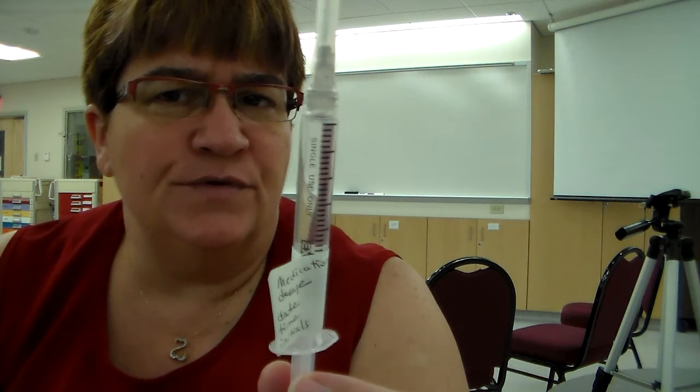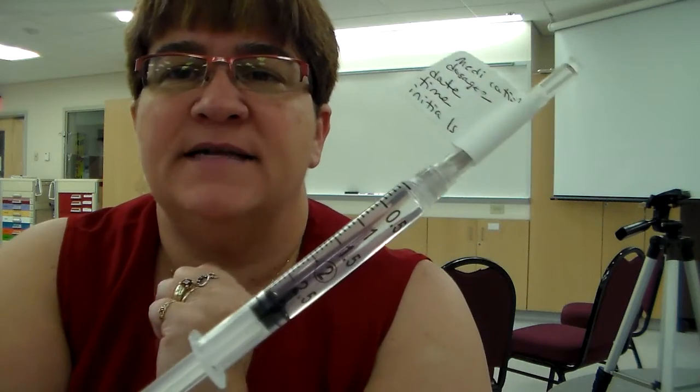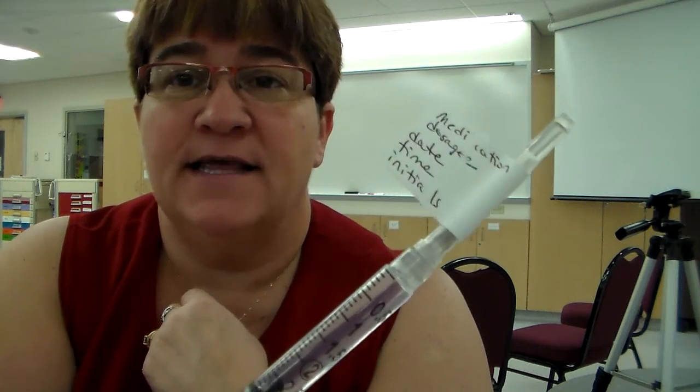What else could you do? You could put it on the cover, right? Because the cover's not going to be there, right? So we could have put that on a cover. Let's see if I can get that on there. I'm probably going to have to tear it. Yeah, there we go. So we could have put it on our cover like this, right? There we go. So now I've labeled it, but I haven't covered up my medicine. I can still see how much medicine is in there, right?